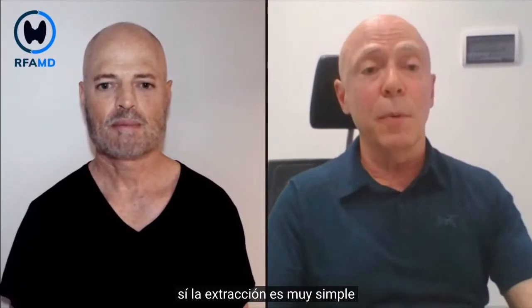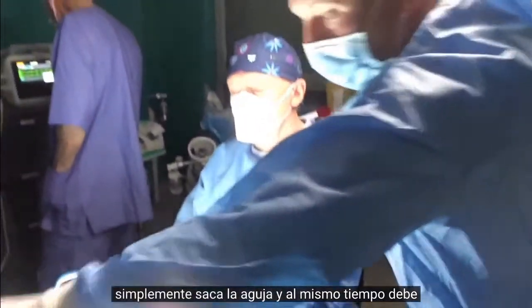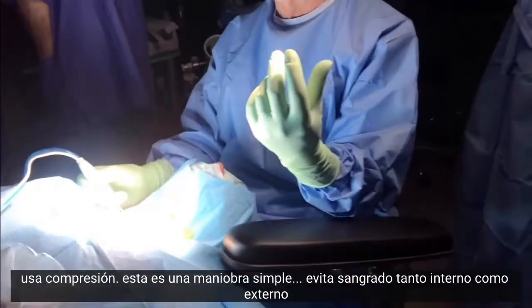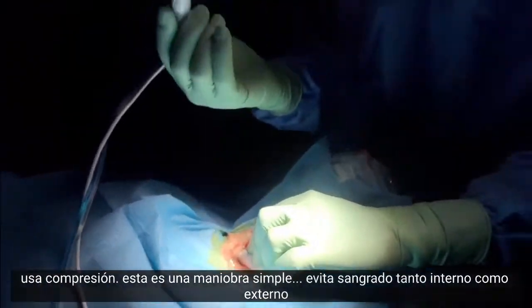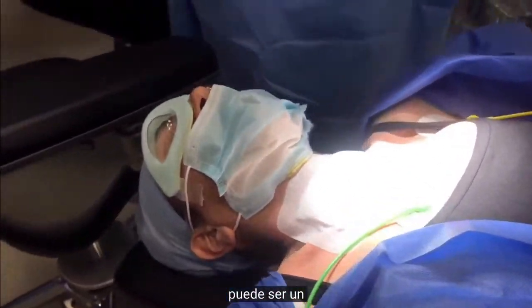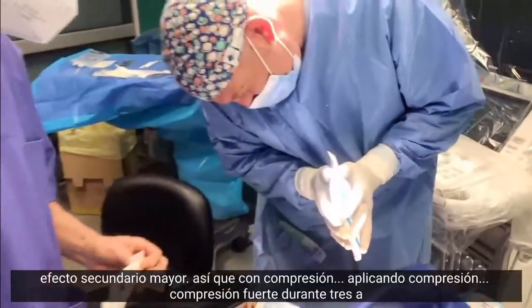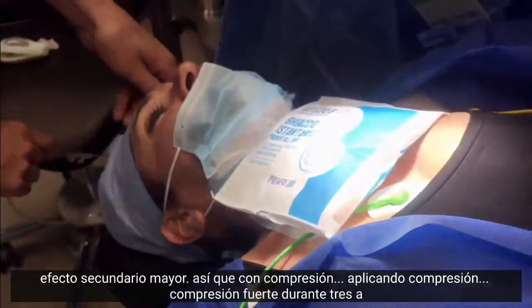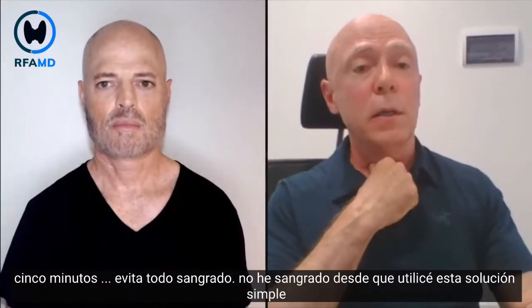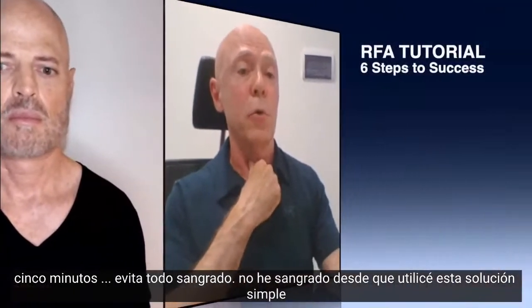Yes, extraction is very simple. Simply take out the needle. But at the same time, compression must be used. This simple maneuver avoids bleeding, both internal and external bleeding. External bleeding is not a major side effect. Internal bleeding may be a major side effect. So with compression, applying hard compression for 3 to 5 minutes, avoids all bleeding. I didn't have any bleeding since I used this simple maneuver.